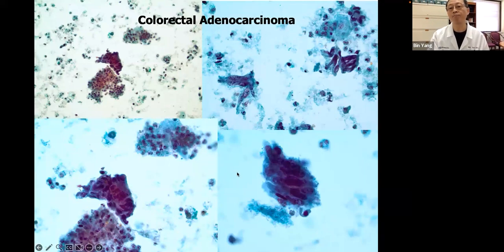This is colorectal adenocarcinoma. The striking feature is a dirty background with necrosis, but we see that these are different cytologically. You have very stratified, elongated, tall columnar atypical glandular cells like this, very characteristic. If you see it once, you're going to think about CRC.